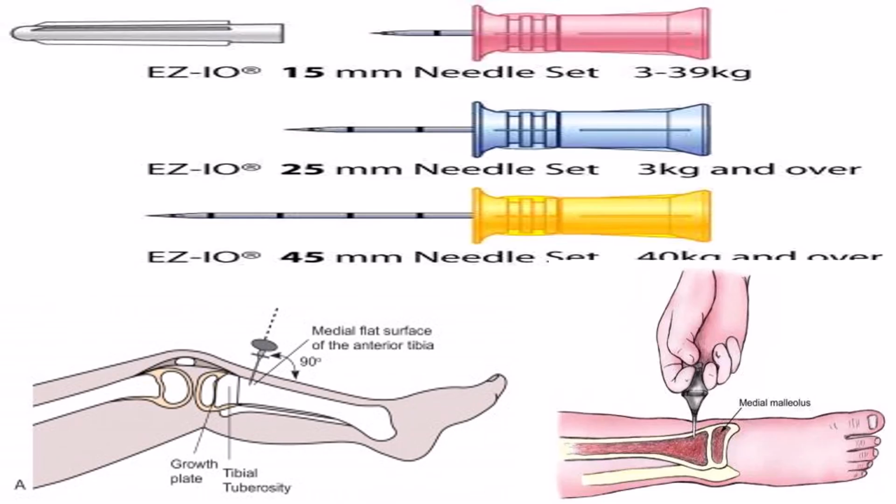First, palpate the tibial tuberosity, then locate 1 finger's breadth below and medial to the tibial tuberosity. The bone can be felt under the skin at this site. Wash the hands and put on sterile gloves. Clean the skin over and surrounding the site with an antiseptic solution. Stabilize the proximal tibia with the left hand. This hand is now not sterile. Grasp the thigh and the knee above and lateral to the cannulation site, with fingers and thumb wrapped around the knee, but not directly behind the insertion site. Then palpate the landmark again with the sterile glove or the right hand.